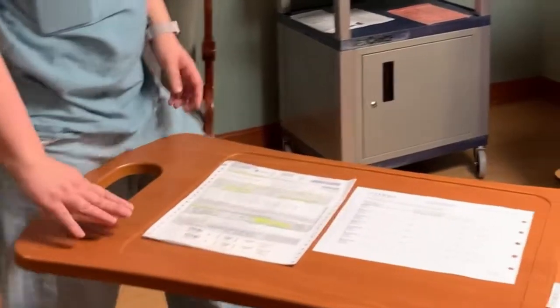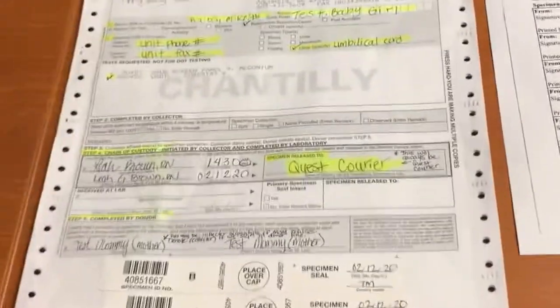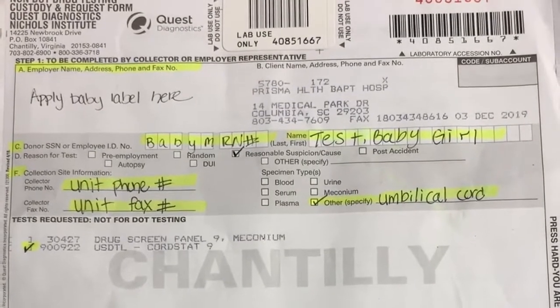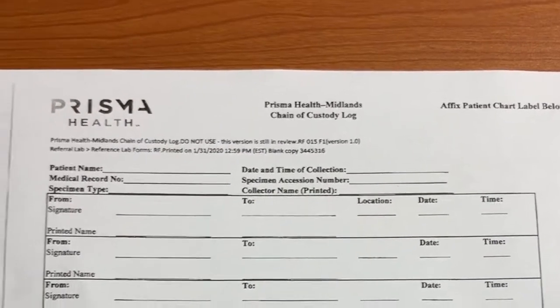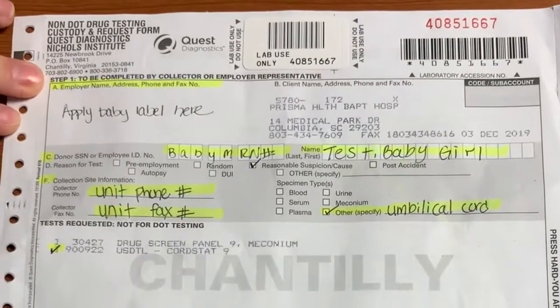Okay, so this instructional segment is covering paperwork. There's going to be 2 forms. One form is from Quest Diagnostics. This is required by the company to go with the cord stat. And then the other is required by Prisma Health chain of custody for who touches it and how it gets down to lab.